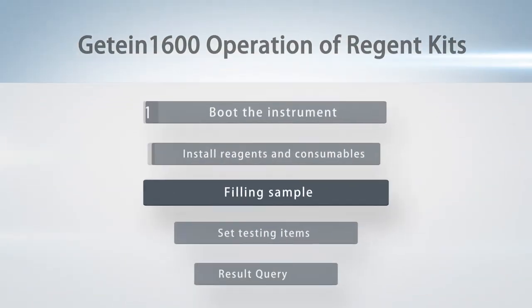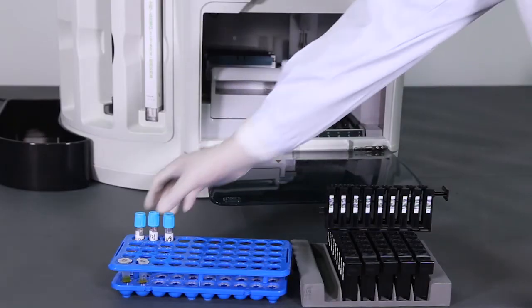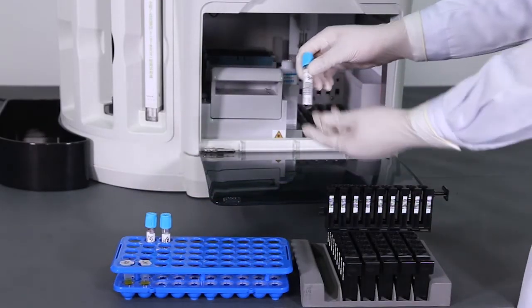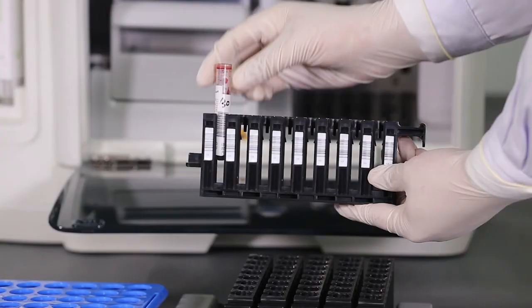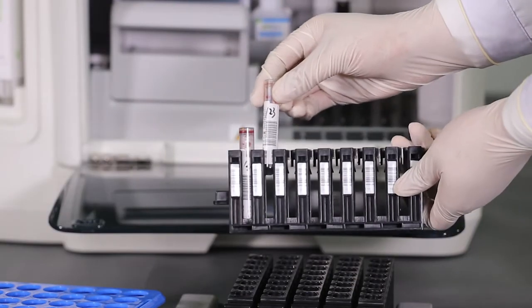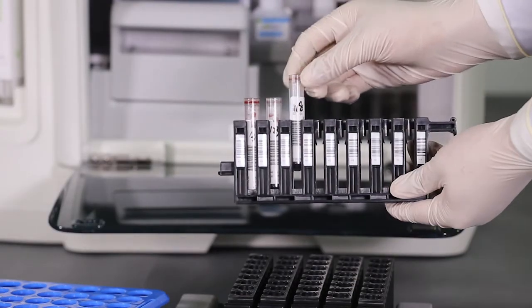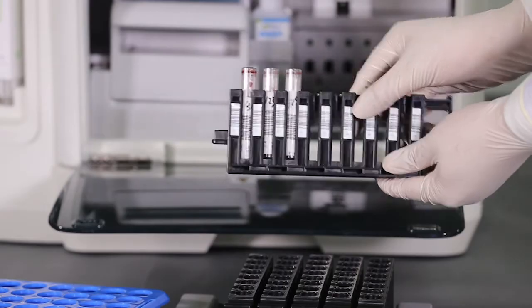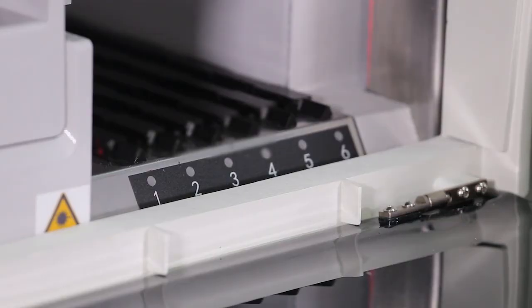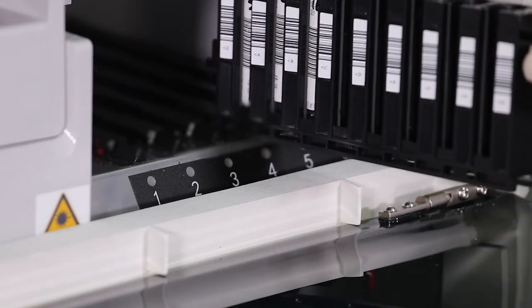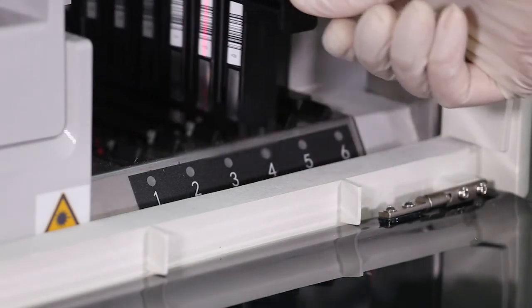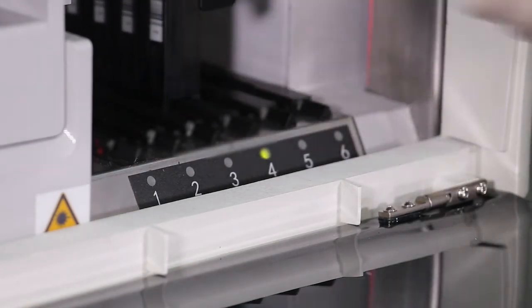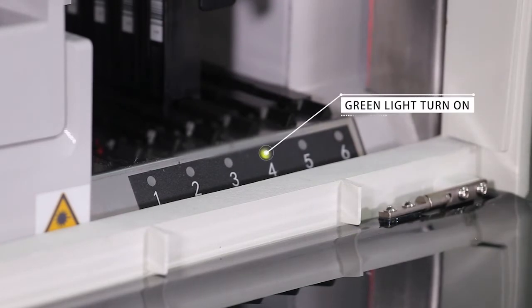Step 3: Filling sample. Remove the tube cover. Place samples into the holder and insert sample holders into the chamber at a constant speed while sample barcode being scanned by the built-in barcode scanner. At this time, green light on the corresponding track will turn on.